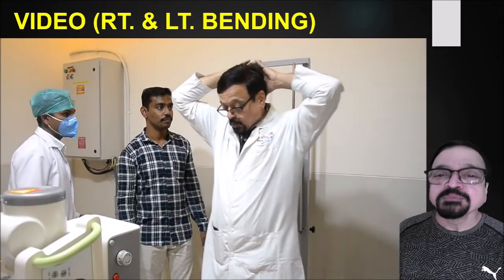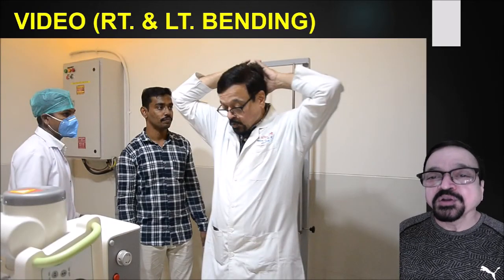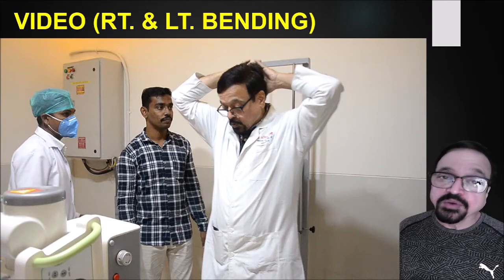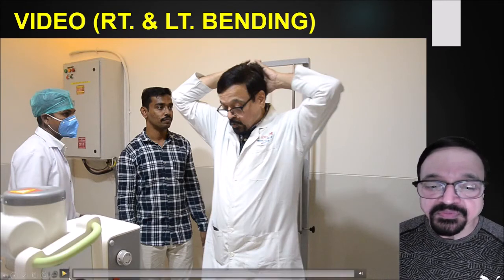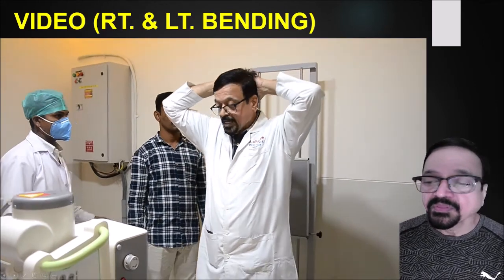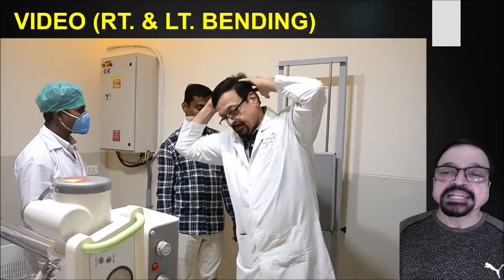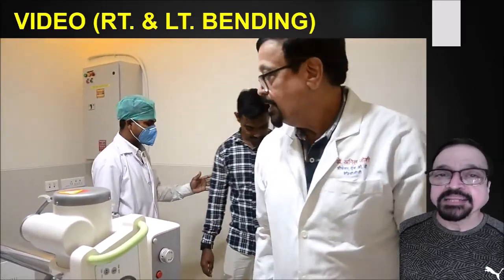Another thing which is important here is the scoliosis workup. In scoliosis you have to have a lateral bending, that is right lateral bending and left lateral bending. Now as far as scoliosis workup is concerned, it is not covered in this lecture. This is one side bending, then this is the second side bending. Side to side bending is extremely essential.